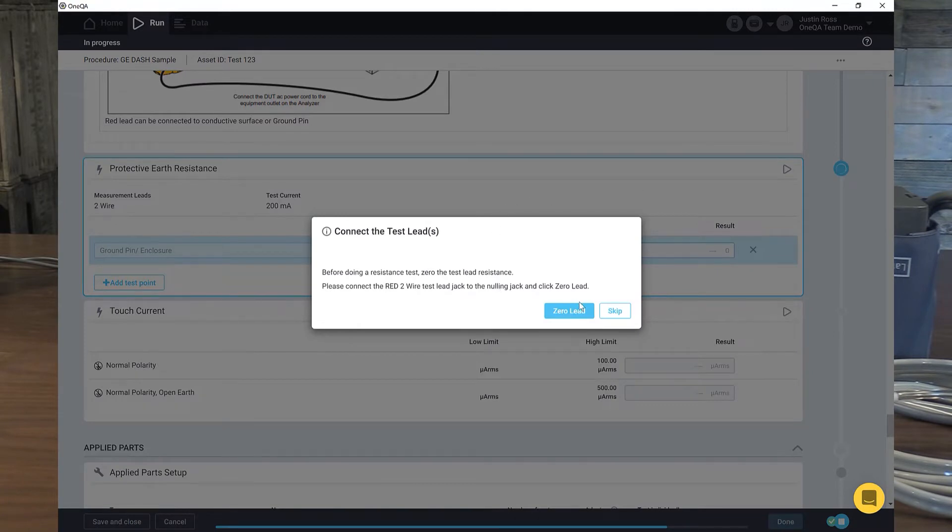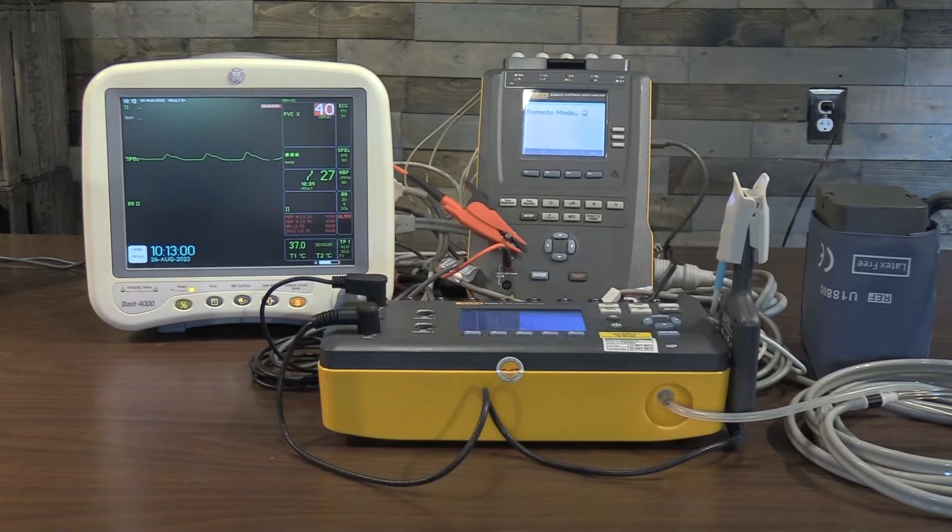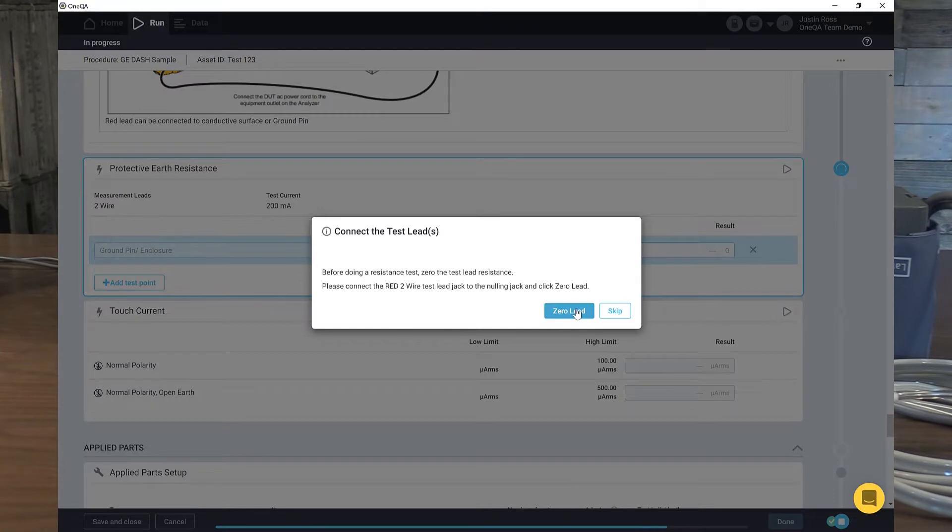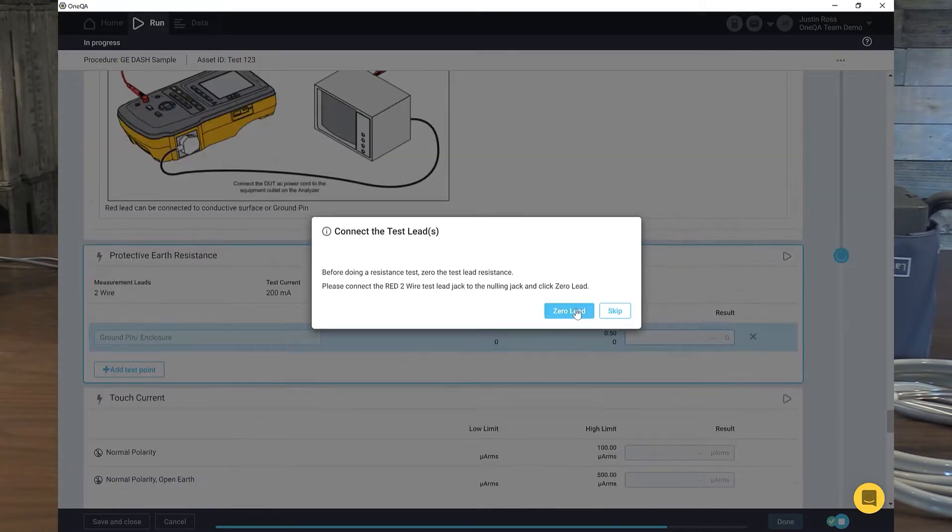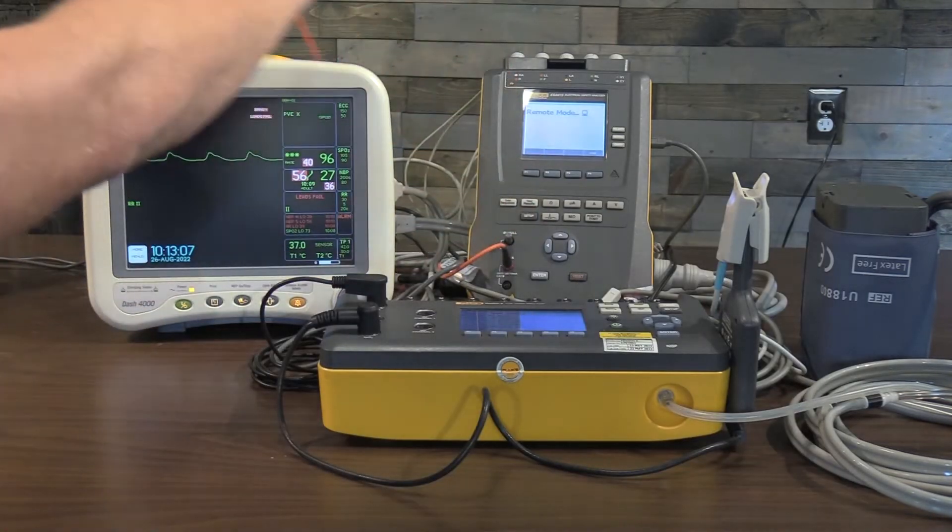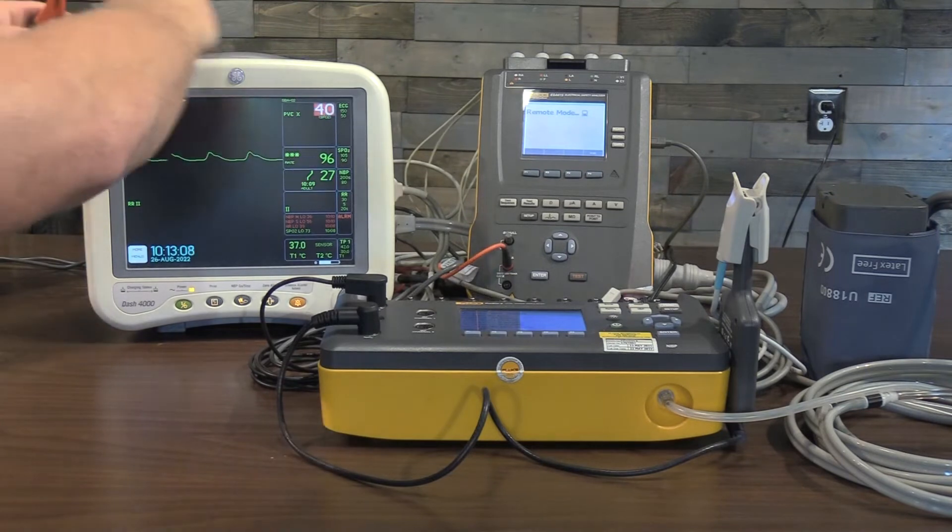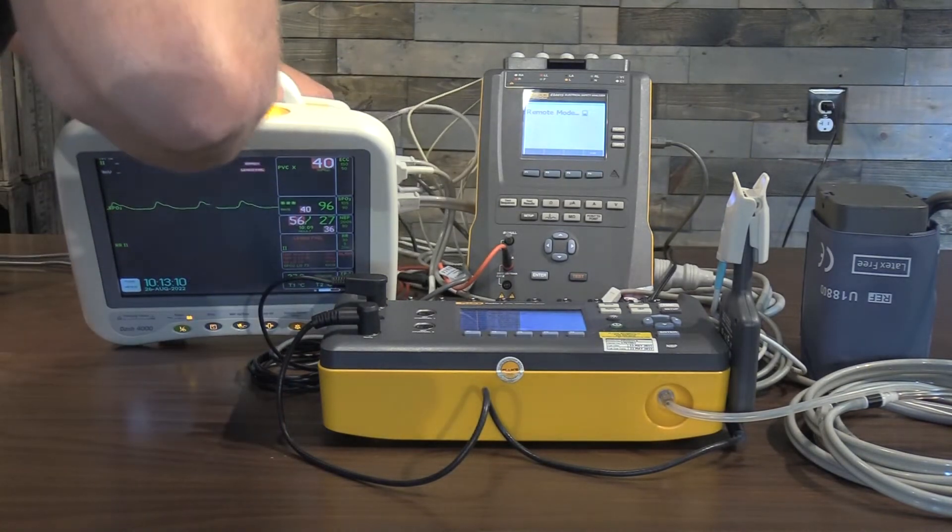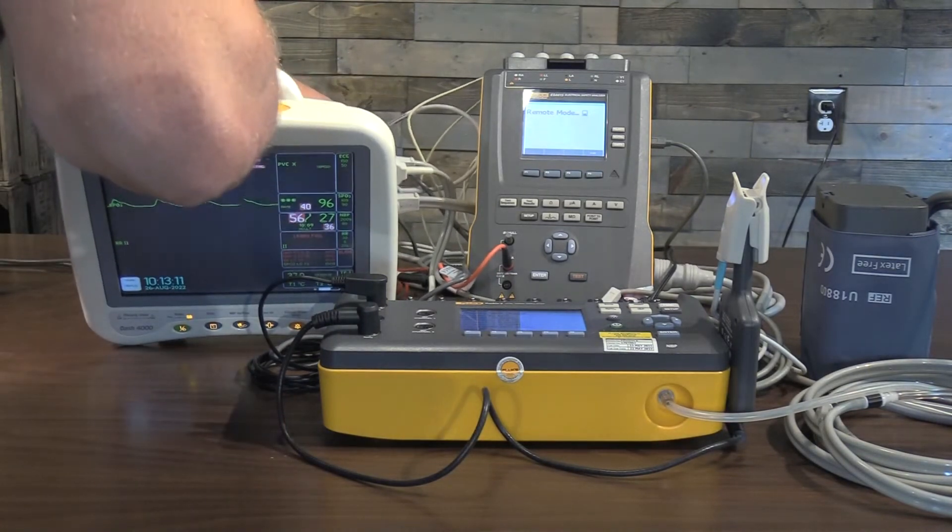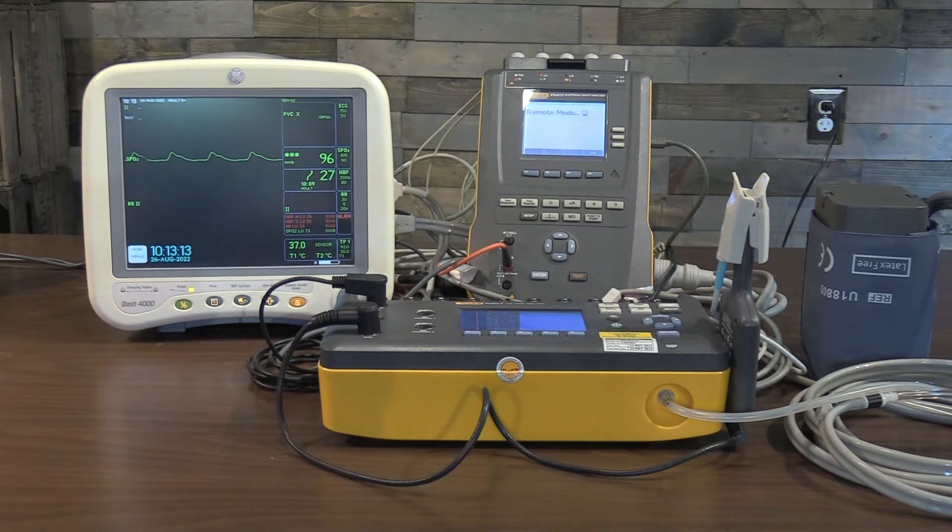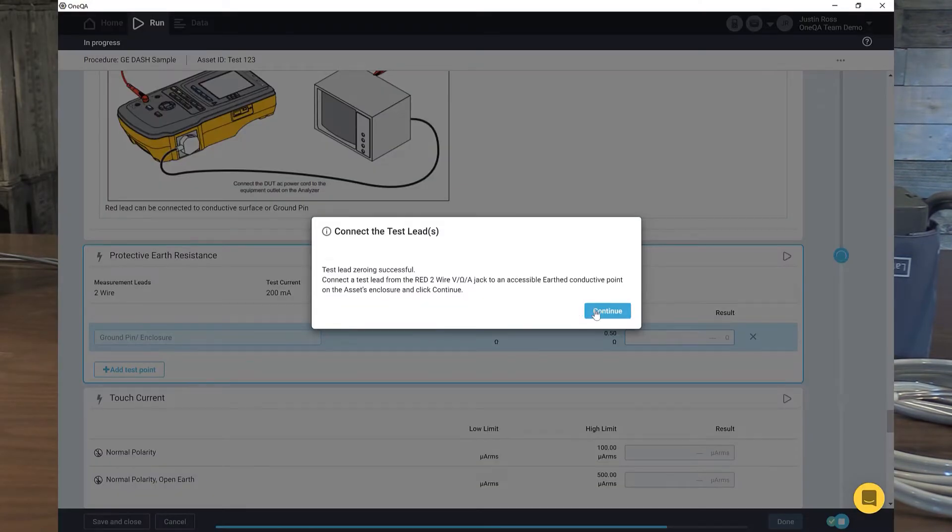Now it wants me to connect it to my null post. Follow my instructions. We're already connected. We'll zero that out. Now we're going to connect this to that test point that we showed in the prior instructions, and we're going to continue.